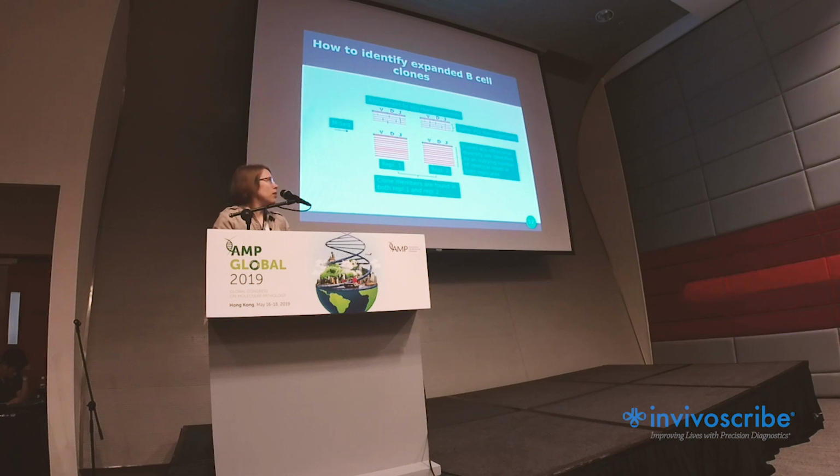So you collapse them normally, and then you would only get one sequence, and one sequence is no sequence actually. So we use sophisticated bioinformatics and statistics to get a threshold above which we consider a clone without intraclonal diversity as a real clone, if we find reads in replicate 1 and replicate 2.